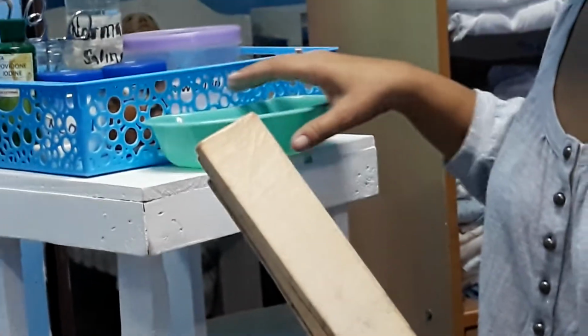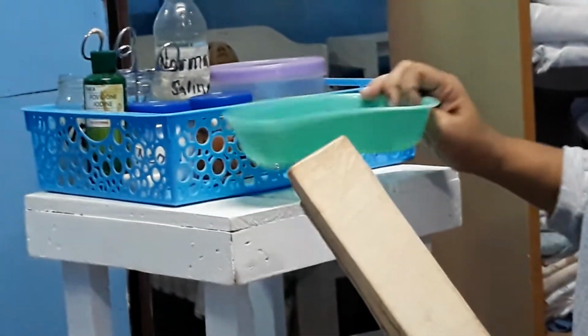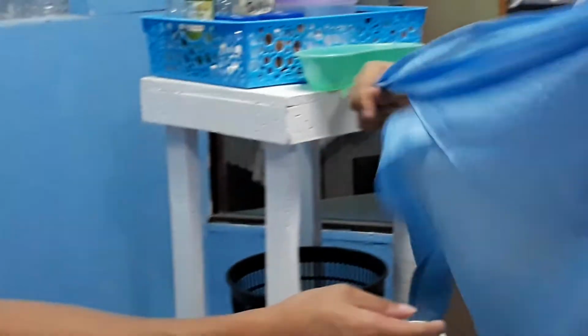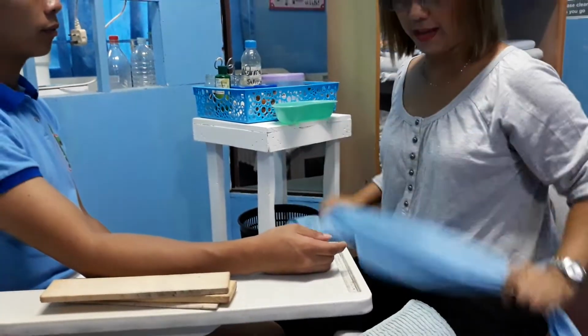Splints are used in cases of fracture. And of course, we have a receptacle, the kidney basin, utilized as your receptacle. Plus, your bandages. Here are your bandages.